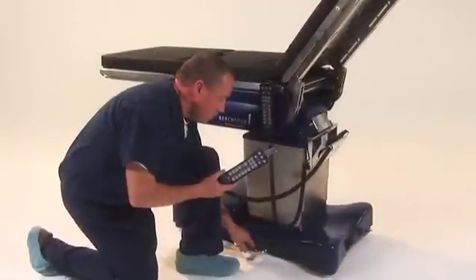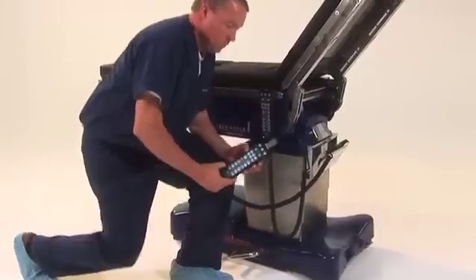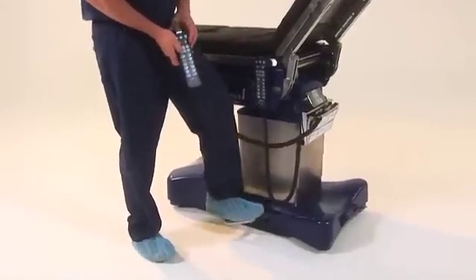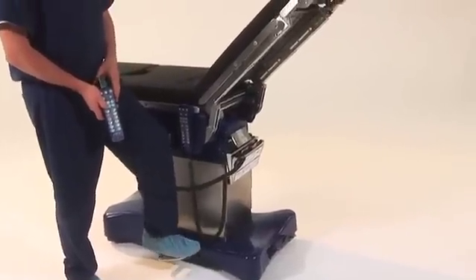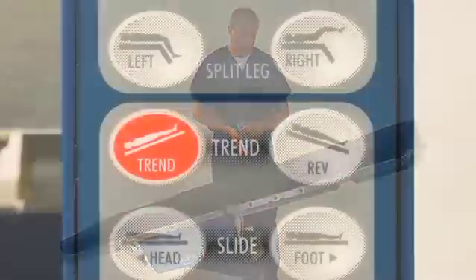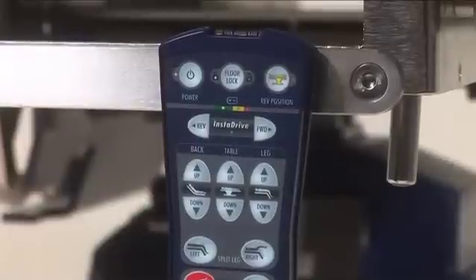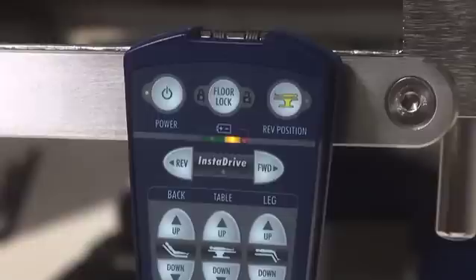Please note that only the functions available in manual mode will be backlit. To lower the back section, press the back down key and manually depress the foot pump until the back section is lowered to the desired degree. To put the table into Trendelenburg, press the red key before operating the foot pump. To remove the table from the room in backup mode, press the floor lock key once, and after three seconds, the table will unlock and can be pushed out of the room.